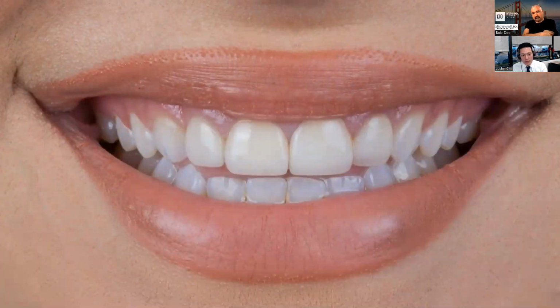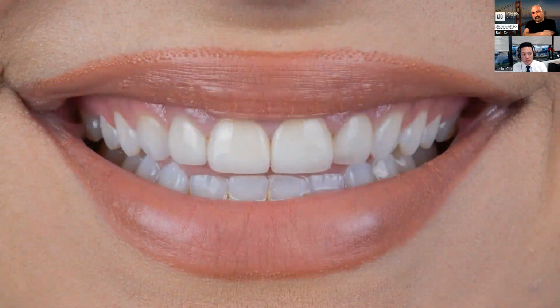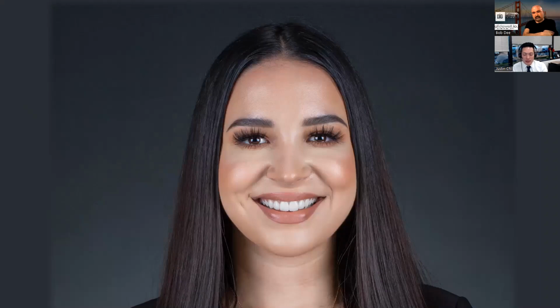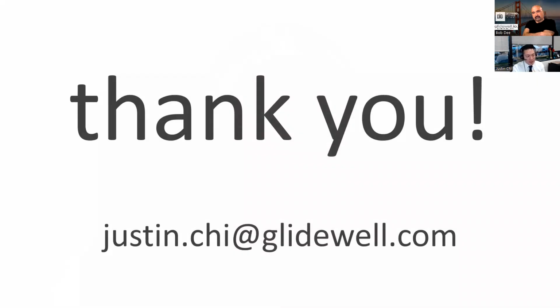Just one more veneer case for you. This patient had veneers 7 through 10 and didn't like the size and shape. I told her, yeah, the proportions are a little bit off. So what we did for her was 6 through 11. I did minimal prep veneers on 6 and 11 and just reshaped and recontoured the preps on 7 through 10. You can see the before of our patient Sam here. It's amazing once you get nice proportions, good size, and still using the system. So you can see no limitations from anterior to posterior, utilizing what we have available, just like what you would get from the lab.